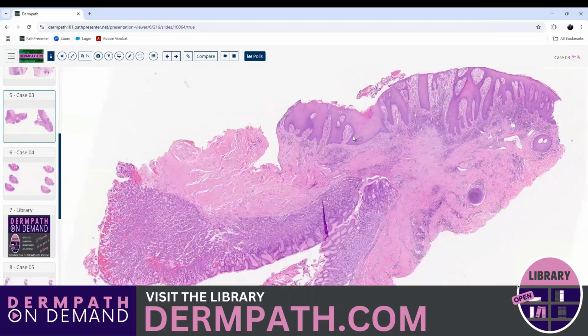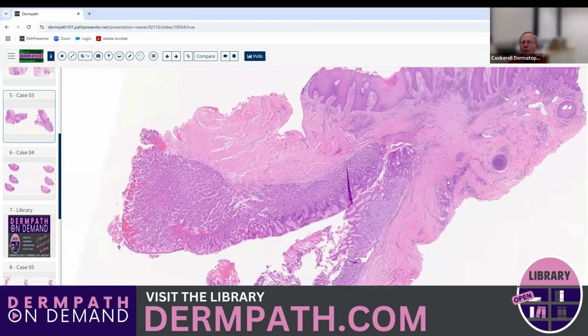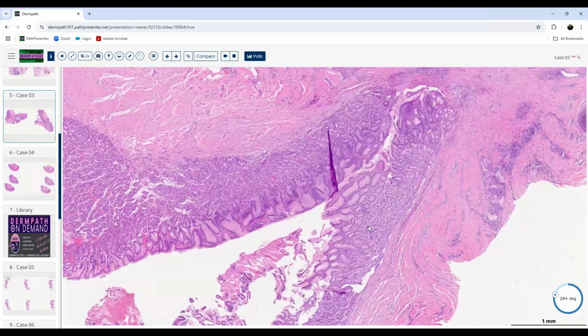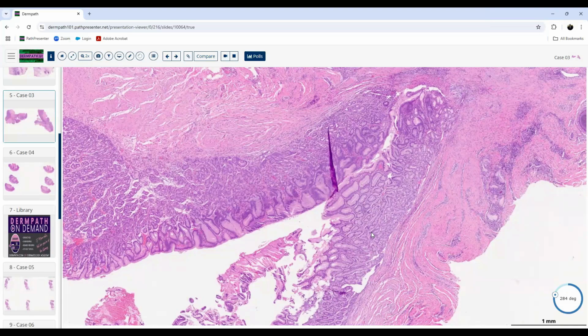Oh, yeah. Was it like a younger patient? I think it was actually an older patient. Okay. It's been present for a very long time. Like a hernia? Well, it actually is similar to that, yes. This is a Meckel's diverticulum, if you remember that. So it's basically the mucosal epithelium of probably the ileum or the duodenum, like an ectopic focus of that.